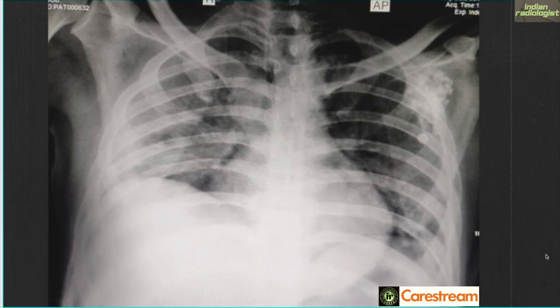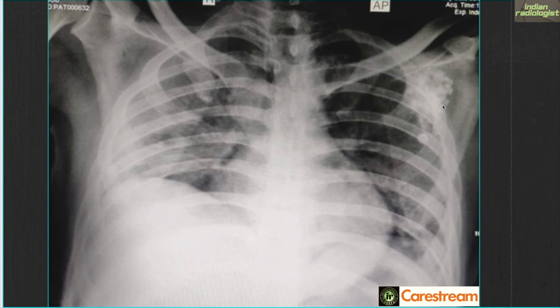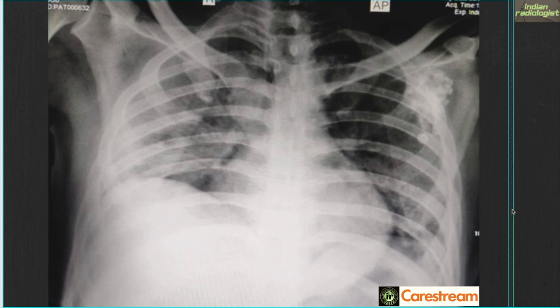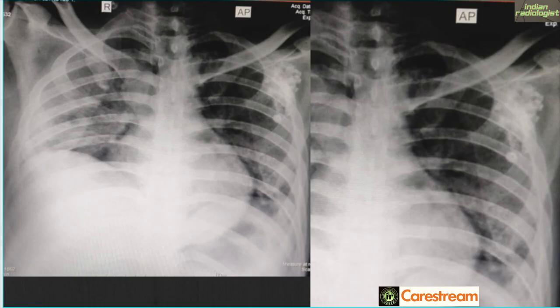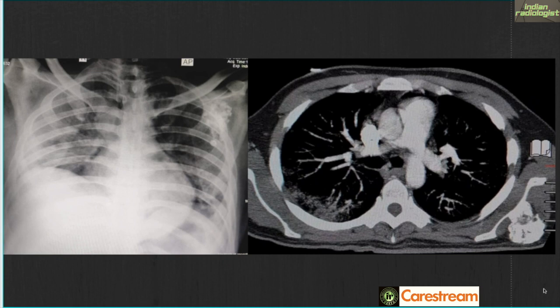This is an X-ray taken in the COVID ICU. We see typical COVID lesions — consolidation in both lungs, more so on the right side. But we need to train our eyes to see beyond the lungs. There is a calcific, slightly lobulated lesion that appears to arise from the scapula or rib. CT scan clearly shows this lesion is arising from the scapula — a dense solid sclerotic lesion, lobulated but smooth — and this turned out to be a scapular osteochondroma.